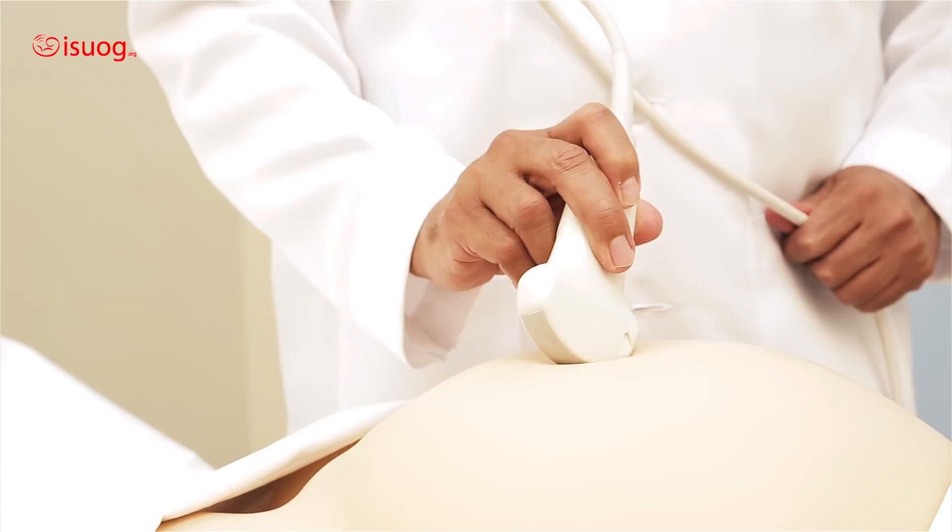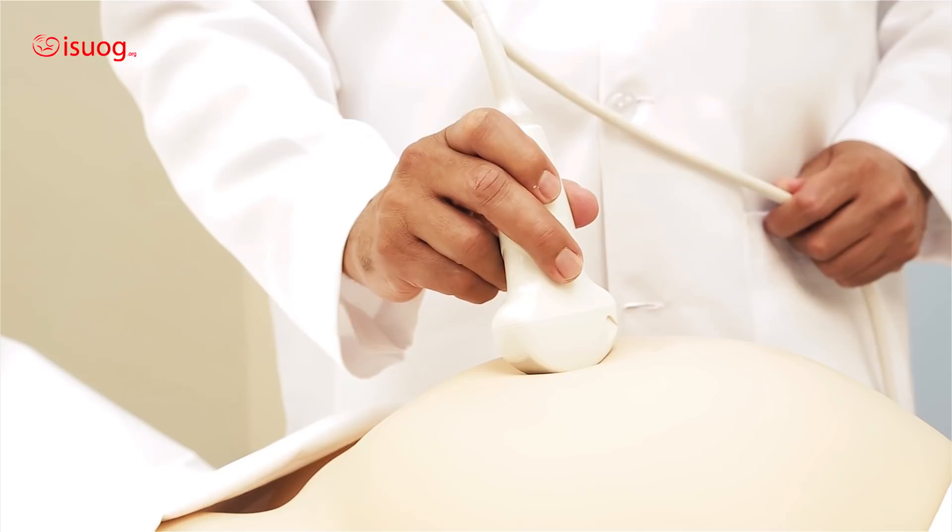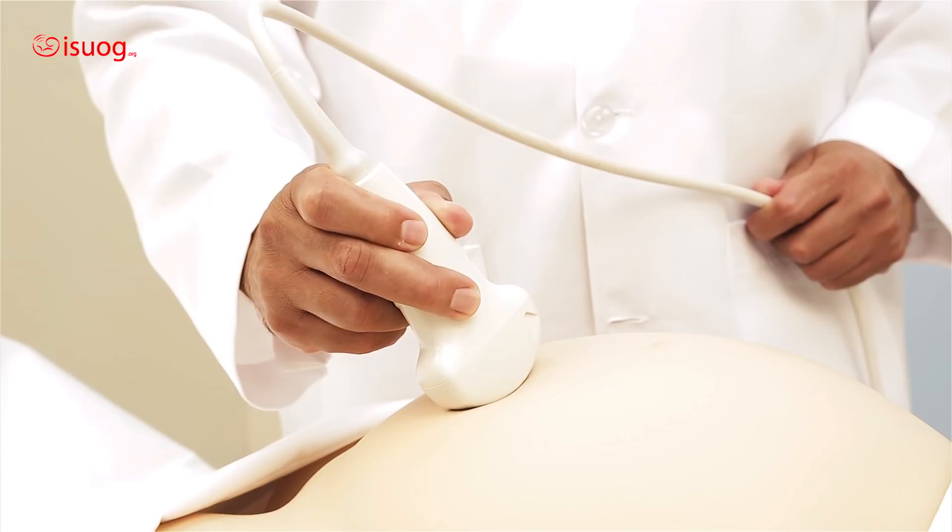Dipping is always followed by sliding on the narrow axis of the probe. So once you dip, you will need to slide on the narrow axis of the probe.